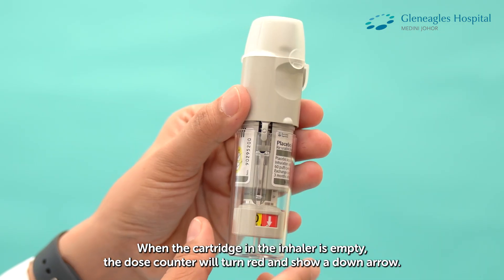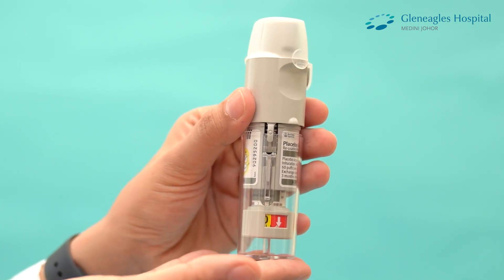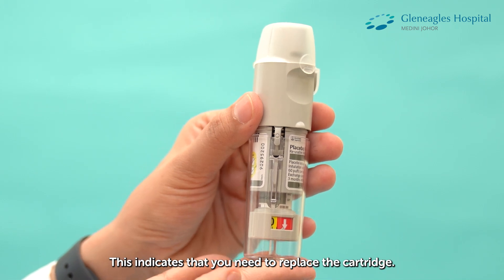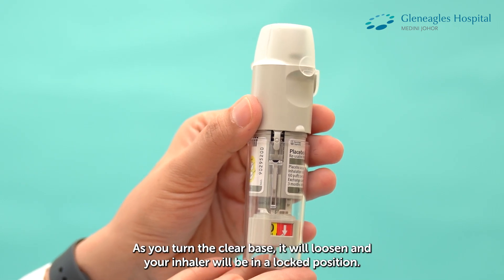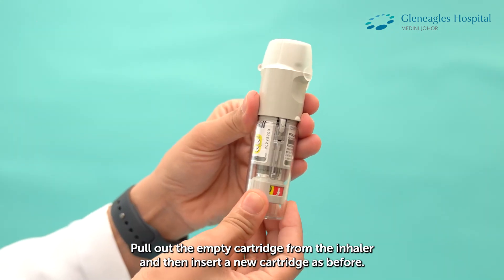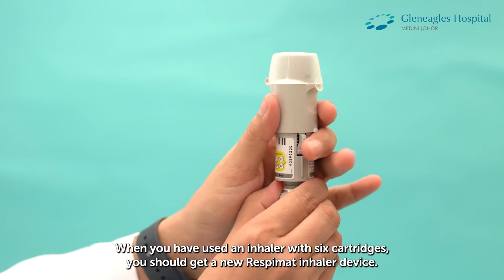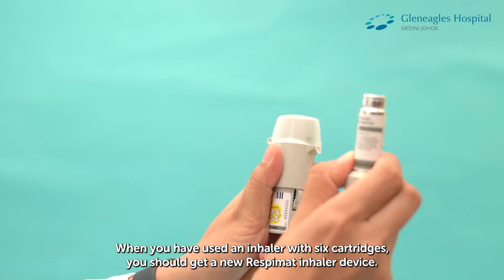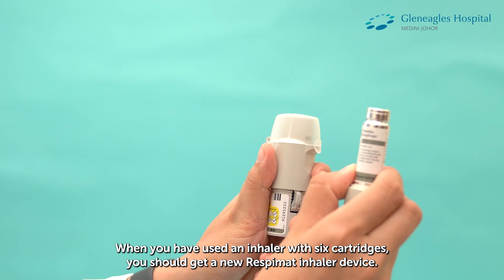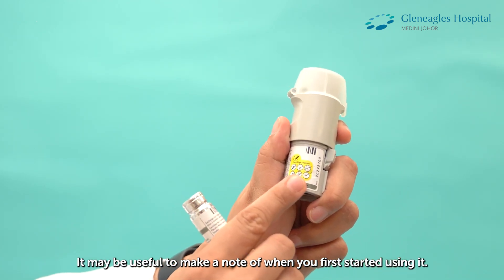When the cartridge in the inhaler is empty, the dose counter will turn red and show a down arrow. This indicates that you need to replace the cartridge. As you turn the clear base, it will loosen and your inhaler will be in a locked position. Pull out the empty cartridge from the inhaler and then insert a new cartridge as before. When you have used an inhaler with 6 cartridges, you should get a new Respimat inhaler device. It may be useful to make a note of when you first started using it.